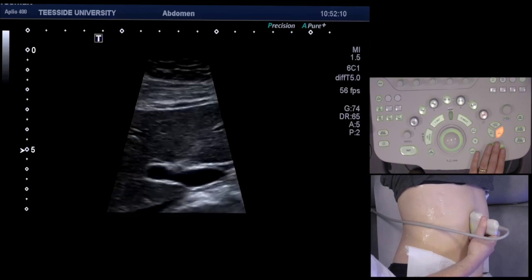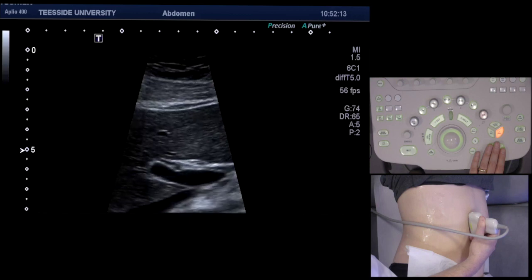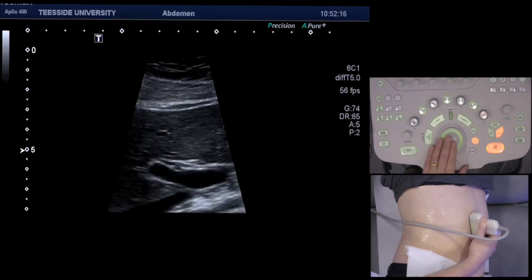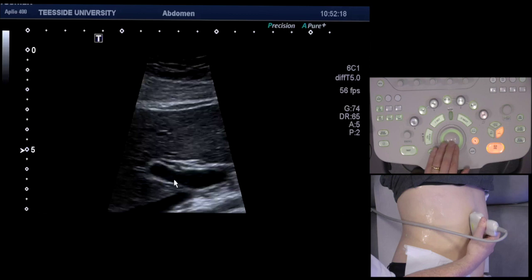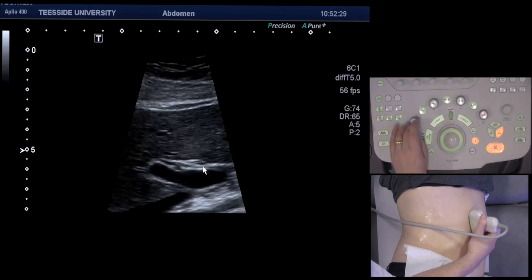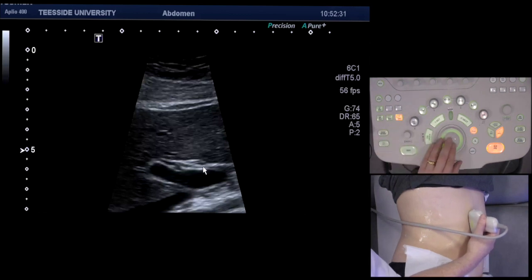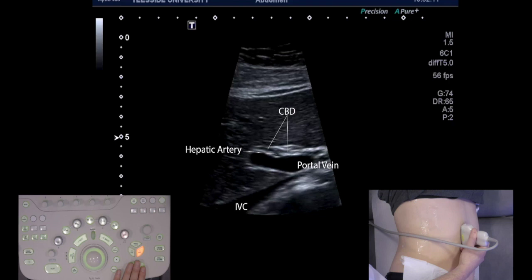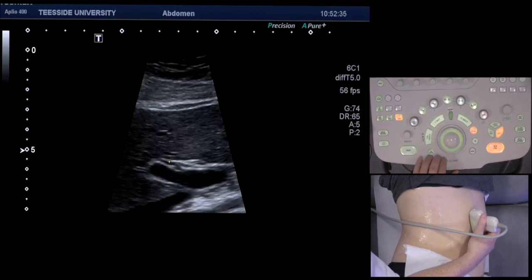To find the common bile duct, you rotate the probe towards the patient's right shoulder, which opens up the gallbladder. This is the IVC, that's the portal vein, the hepatic artery, and you can see the tiny CBD along the top. Normal diameter is six millimeters, but you can also allow one millimeter per decade of her life. Here you can see the IVC, portal vein, hepatic artery, and CBD in more detail. We'll now measure the CBD, which is well within normal limits.